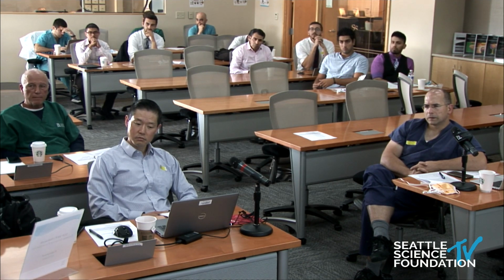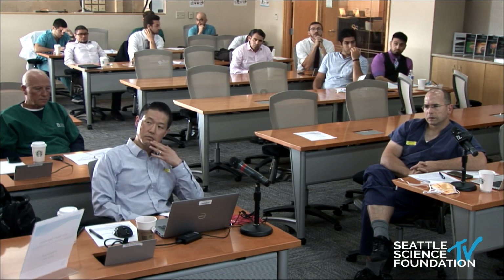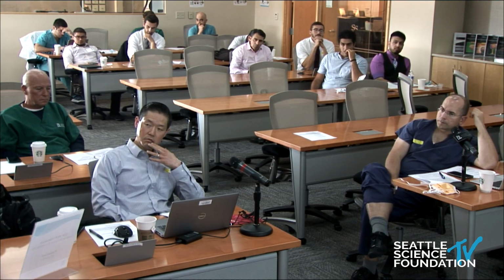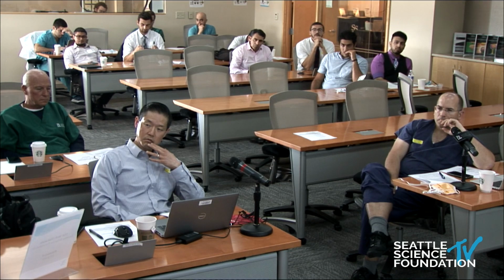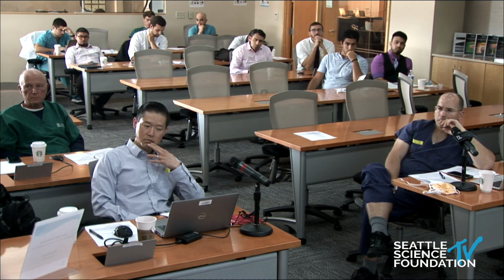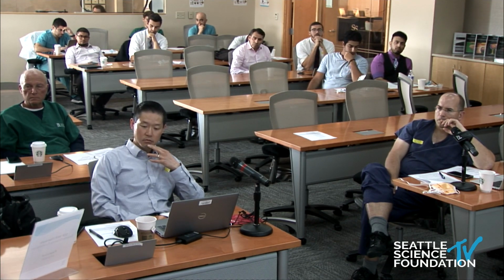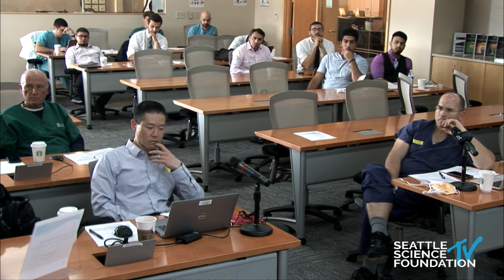So sometimes, if you're getting a positive return at a lower current than you're expecting, one of the things you can do is lift your dilator up, work it anteriorly and kind of pull the psoas back. That's a trick I've learned from other folks as well. So I think like anything else, you just have to do enough of them. You have to have a few cases where you struggle, work your way through it, and you learn all these different pearls to get yourself out of trouble and put yourself in an area where you can be successful with the surgery.